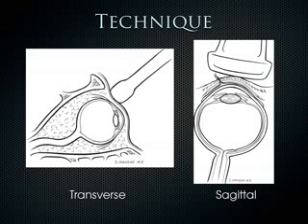In order to visualize the entire ocular contents, the patient can be instructed to gaze to the left, gaze to the right, gaze up, and finally gaze down. And this may be repeated several times until you have sufficient information to render a diagnosis. And so I have the patient look all around like that, and that seems to really help.